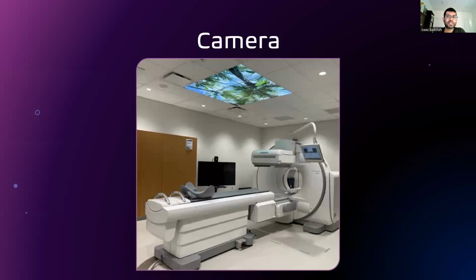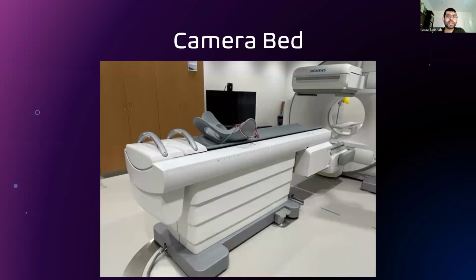There are three main sections of the gamma camera that we will cover today: the patient bed, the detectors, and the patient positioning monitor. The camera bed is where the patient is positioned in order to carry out their scan. The pallet release should only be used in emergency situations, for example, to remove a patient who is stuck.